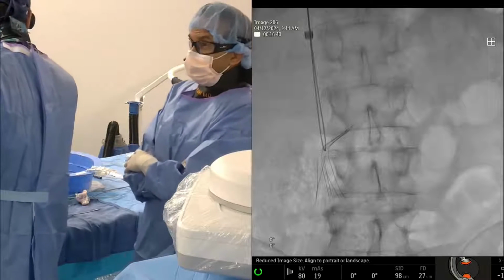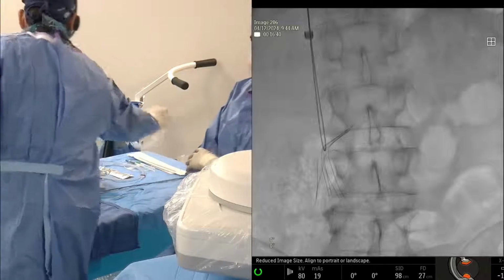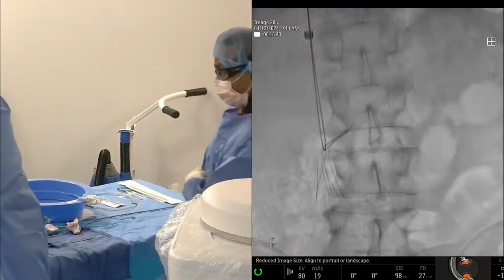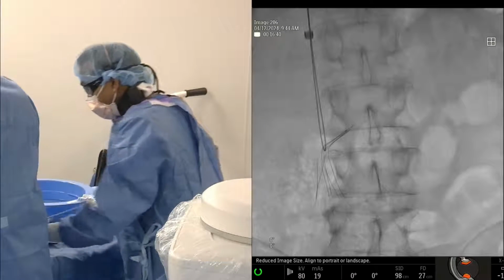Because I just think that we're going to actually wind up making it even more distorted and disrupting the filter itself. Yeah, I think most of us would go forceps here. That would be the way to go. Yeah, I think most of us would go on as well. Okay, good. We'll fix that in a moment.